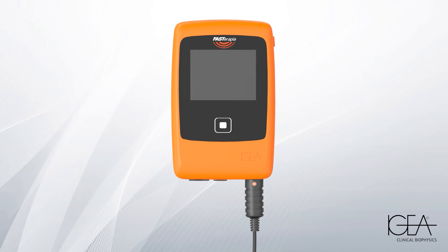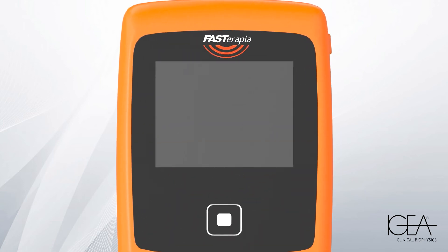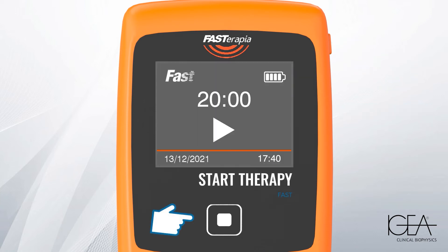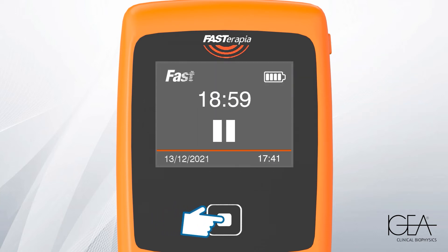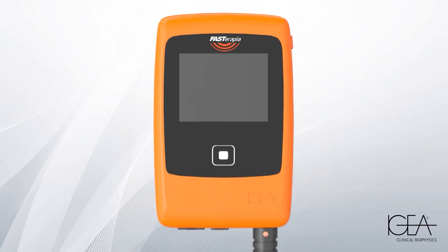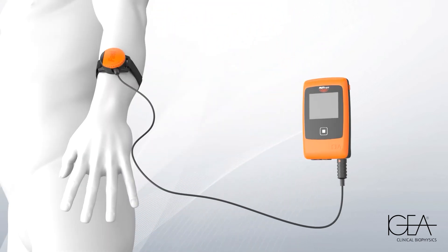Turn on the device by pressing and holding the side button. Press the central button to start a therapy. The treatment parameters are preset according to your condition. The device uses undetectable frequencies, so don't worry if you don't feel any sensation. The treatment stops on its own after 20 minutes. It can be repeated a maximum of twice a day.